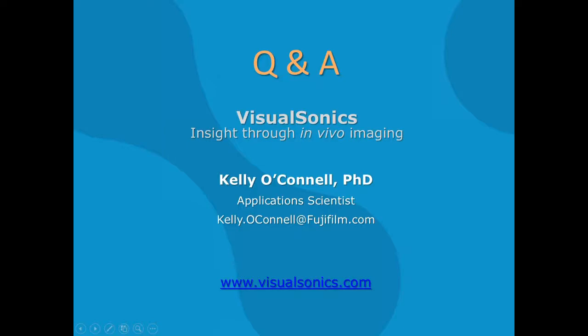All right, great. Thanks, Kelly. That's an excellent presentation, a great overview of strain and all the possibilities. We've had some questions coming in while you've been talking. One of them I can answer right off the top. There was a question about 4D on the Vevo 3100 and 4D strain. This is not possible with any of our software yet, but we are actively researching that.